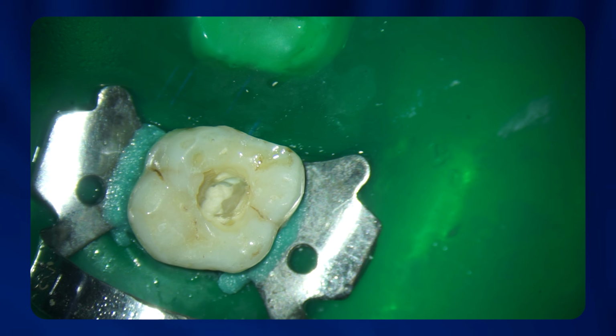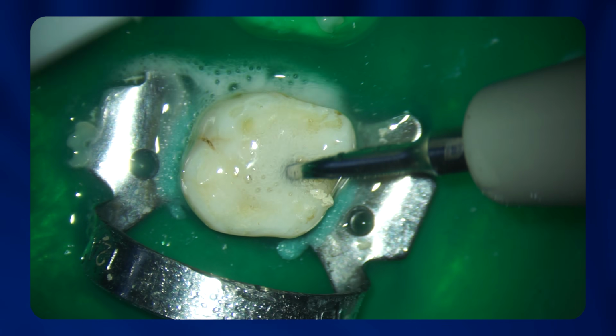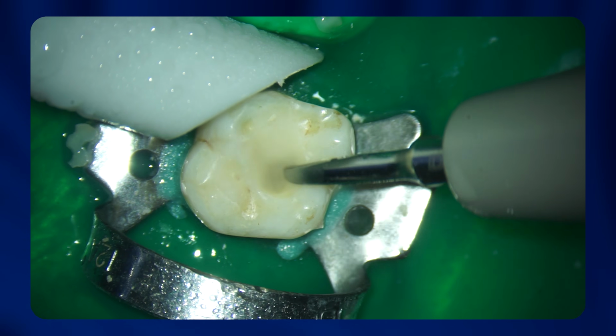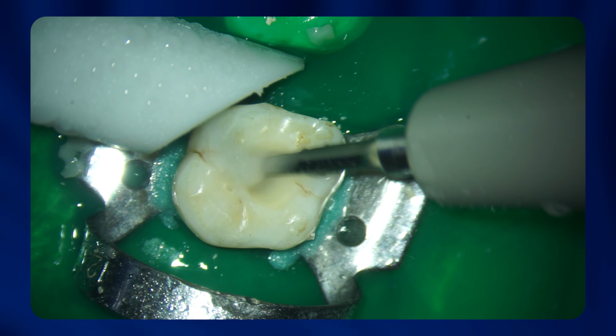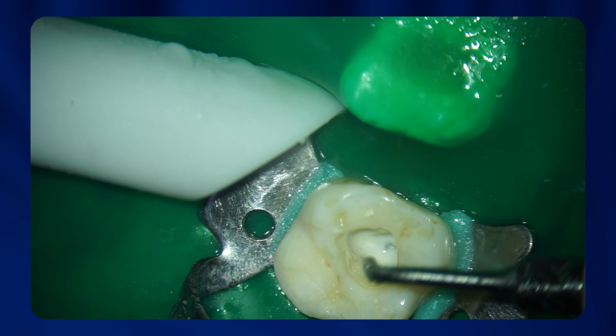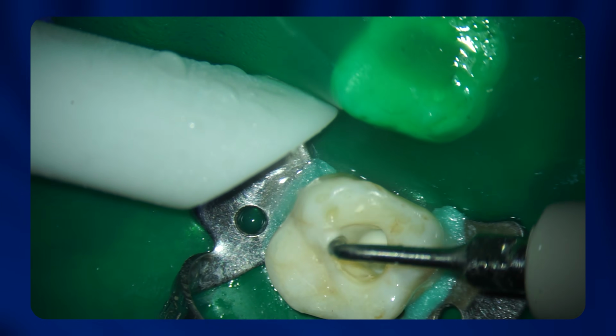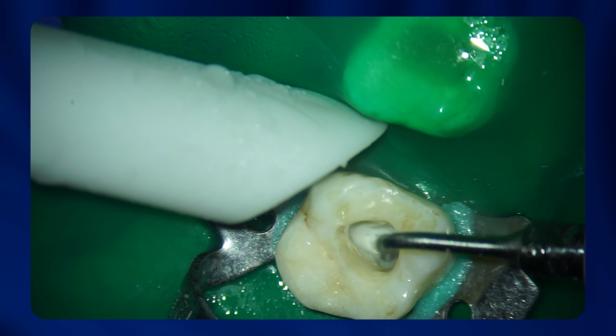You can even use routine ultrasonics, what you use for scaling. You don't even need a specialized endodontic ultrasonic tip. Here you can see me using the regular ultrasonic tip which we use for scaling. You can use that and it easily removes the Cavit underneath. Yes, if you want to go deeper into the canal, you can use an endodontic ultrasonic tip as well, which removes all the debris or the Cavit which is sticking onto the pulpal floor. You can use an endodontic ultrasonic tip and it easily removes all the Cavit there.